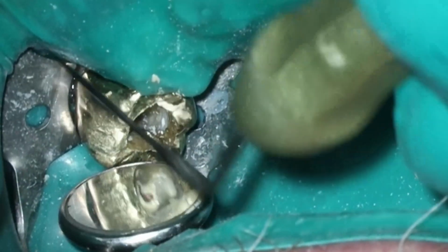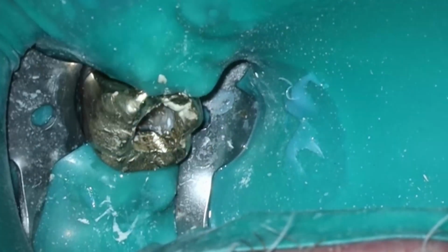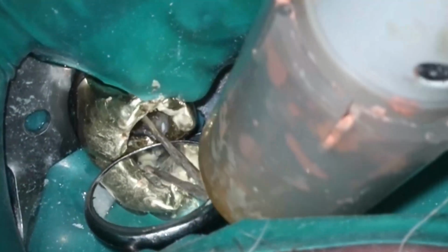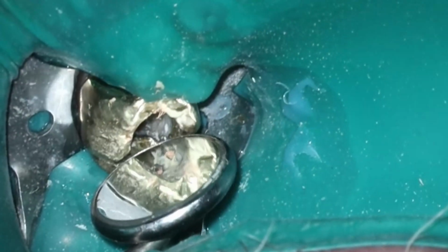It doesn't work great in cases where you're ledged or cannot get to patency because there's nowhere for the space to go. And that's why in these cases, you'll see I almost always have a sealer puff, because that pressure is going to hydraulically push the sealer and the gutta percha through the apex and get a little puff of sealer out if you do everything properly.